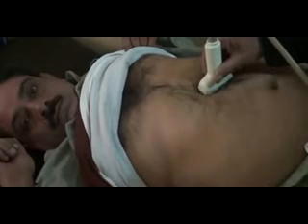This is where I am getting the superior mesenteric artery in transverse section. I have to give a little bit of pressure in this patient because he is bulky. Now I am going to give approximately a 60-degree angle rotation to the probe, keeping it where I was seeing the superior mesenteric artery, and you will come across the common bile duct at the head of the pancreas.